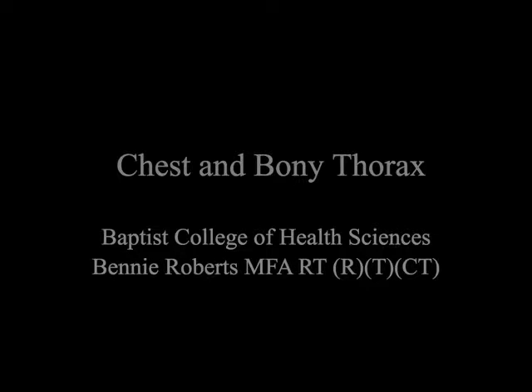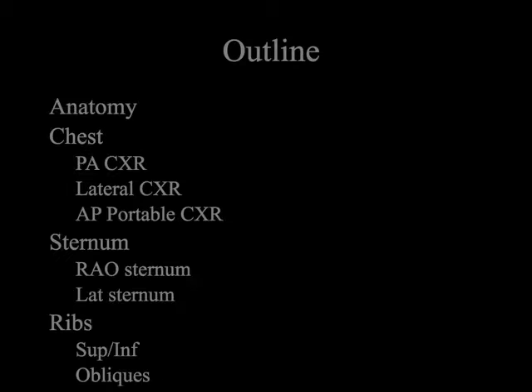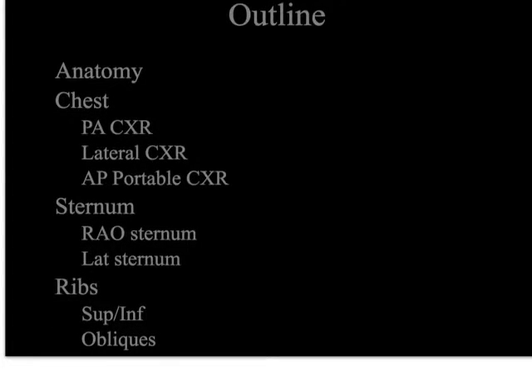Okay, let's spend just a little bit of time talking about how to evaluate images of the chest and bony thorax. And here's an outline of the material we'll be looking at in this lecture. I should point out that I'm looking specifically at Merrill's, which is the 13th edition, volume 1. So if I'm calling out page numbers, it's from that text.